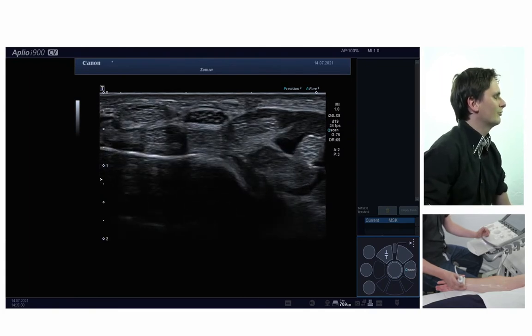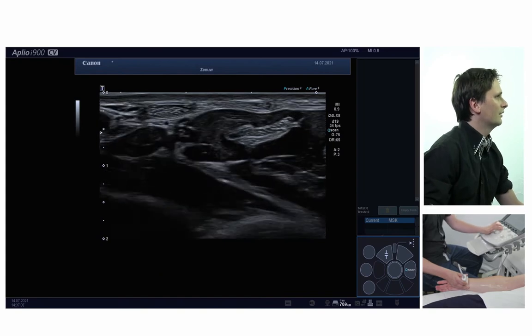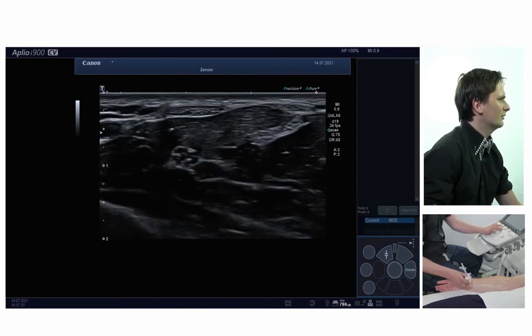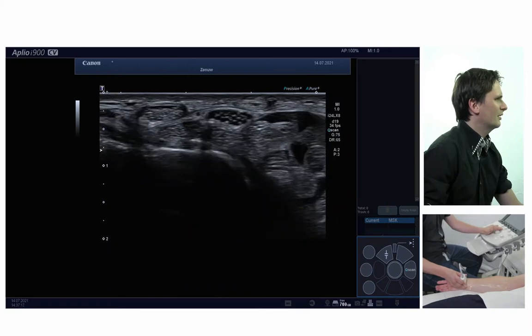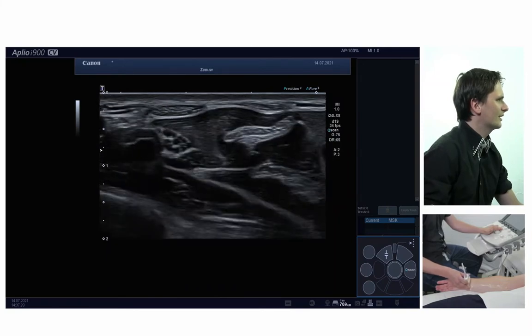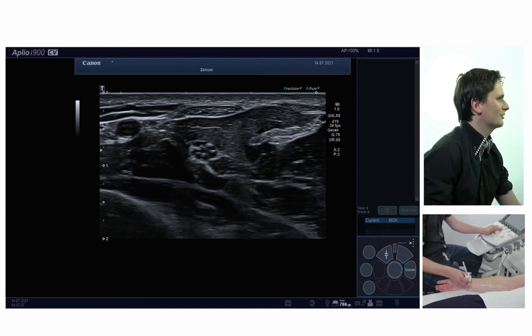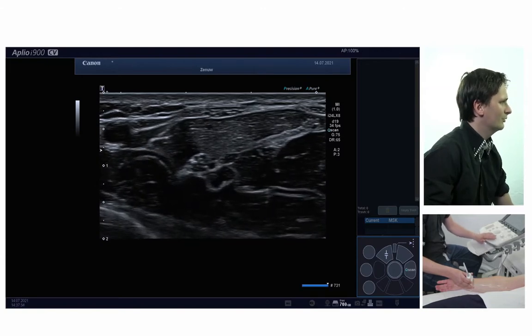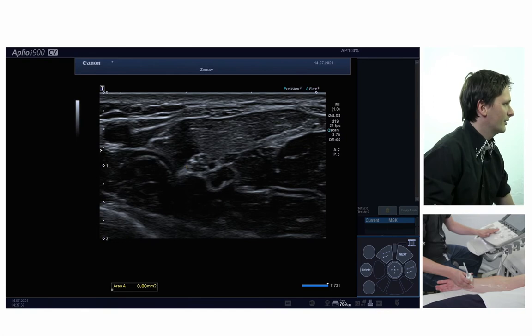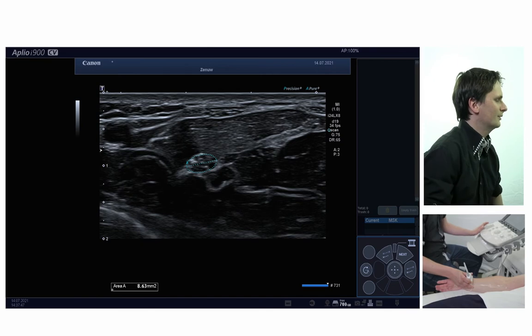Then I'll follow the nerve more proximally, and there it will make a C-turn, as you can see on the screen. It runs along a C-turn tract and will run between the superficial flexor digitorum muscle and the profound flexor digitorum muscle. You can measure the nerve in the forearm as well, again within the hyperechoic rim. Here it has a surface of 8.6 millimeters squared — that's normal as well.